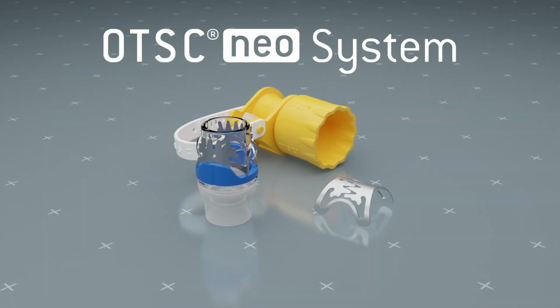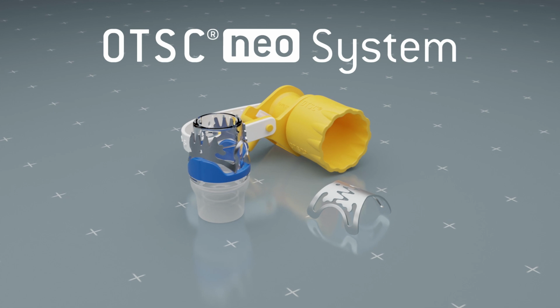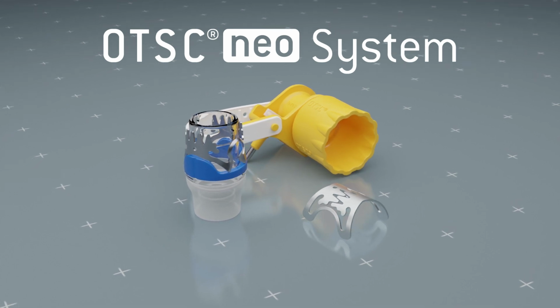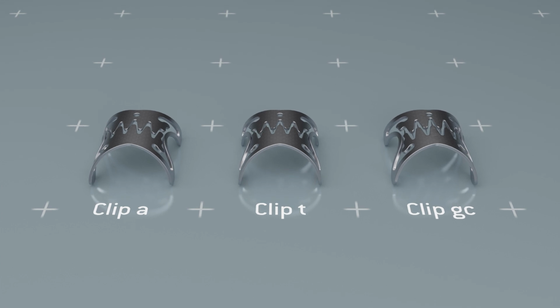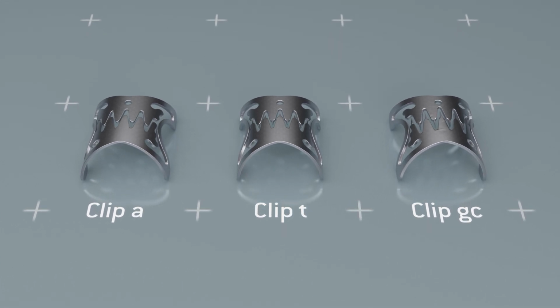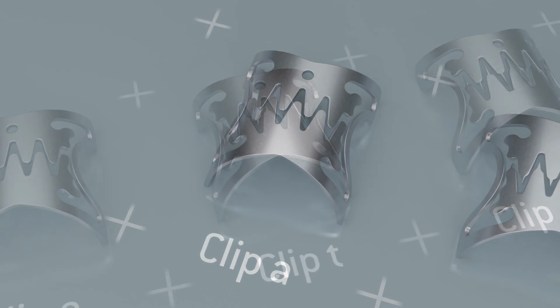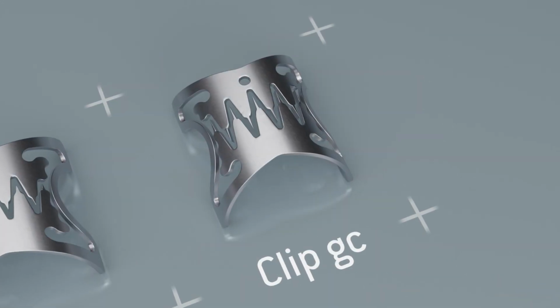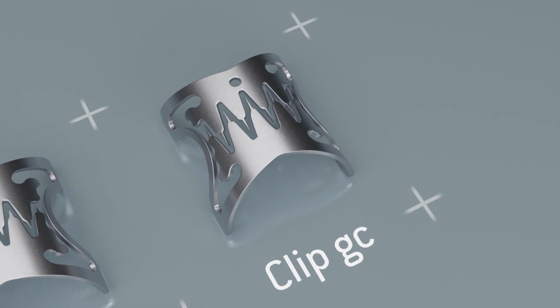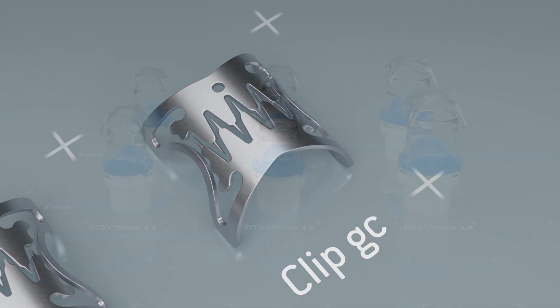The OTSC Neo system set is an instrument for flexible endoscopy for the treatment of lesions in the gastrointestinal tract. There are 3 different versions of the OTSC Neo clip: Type A with blunt teeth, Type T with pointed teeth, and Type GC. For PEG fistulas in the stomach, the clip Type GC is particularly suitable.